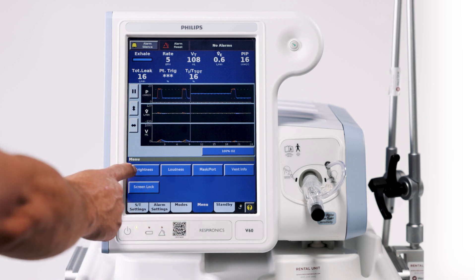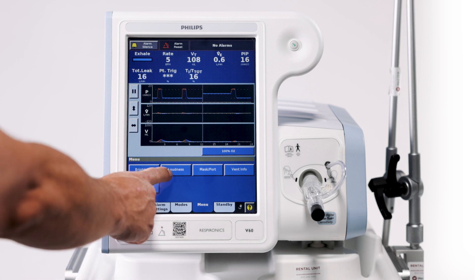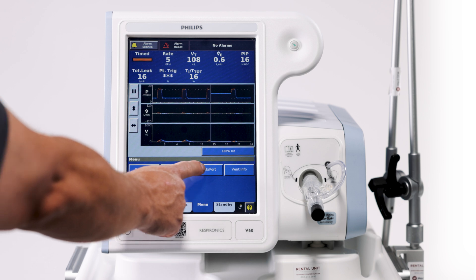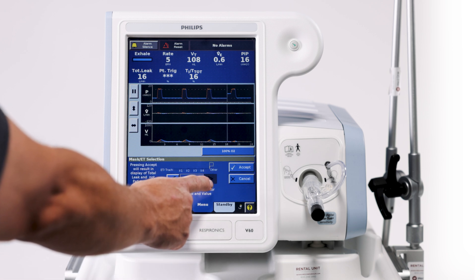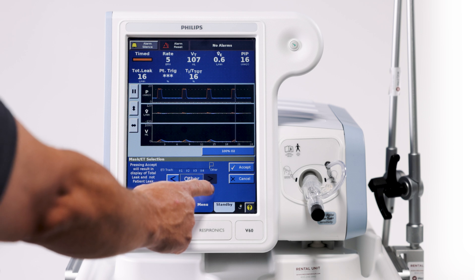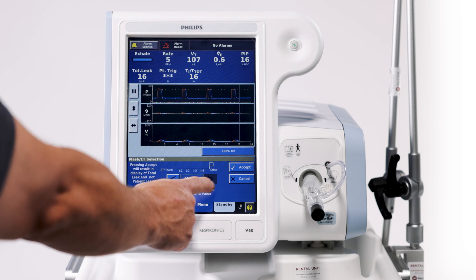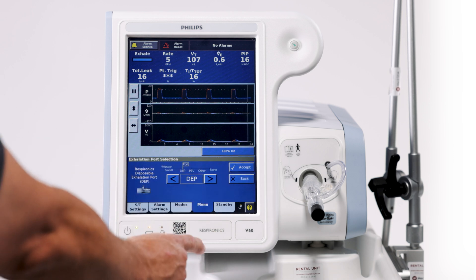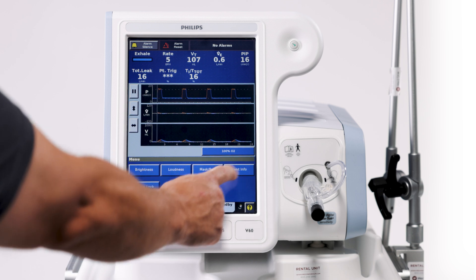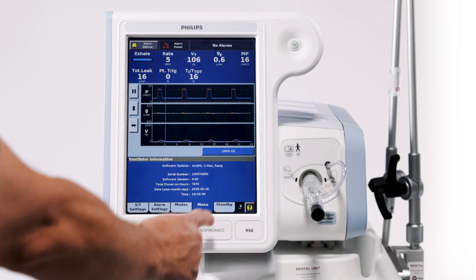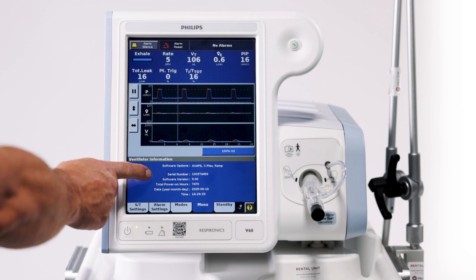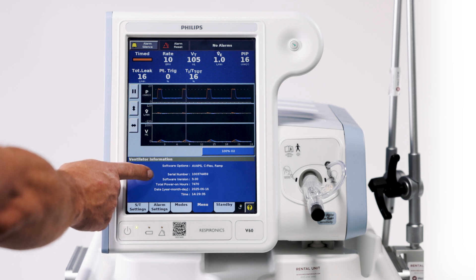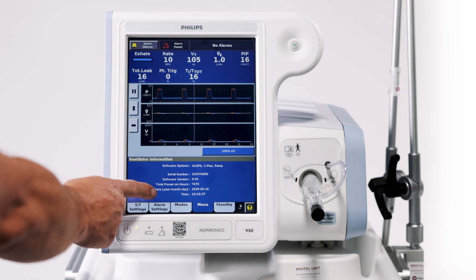In the menu, we have a brightness adjustment for our display, alarm volume, and our mask configuration — depending on what you're using, that can be set in this window. Ventilator info will display the software version, the hours of the ventilator, and the time and date.